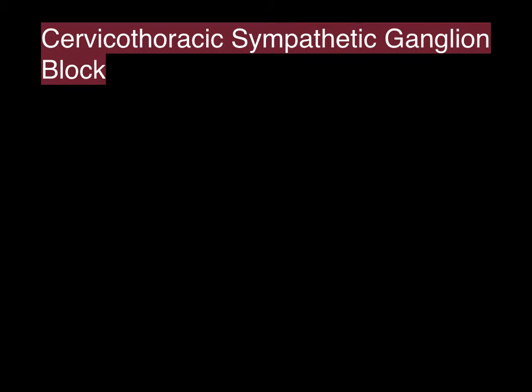Today we are going to discuss stellate ganglion block, how to do it and who should be doing it. In my opinion, every anesthesiologist should know how to do it, and they would be better helping the chronic pain physicians, those who do not understand or are not very proficient with ultrasound.